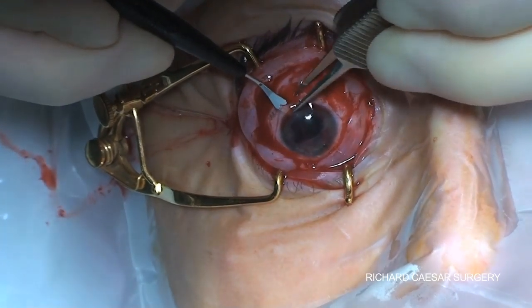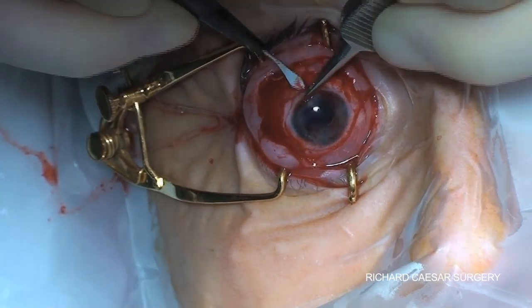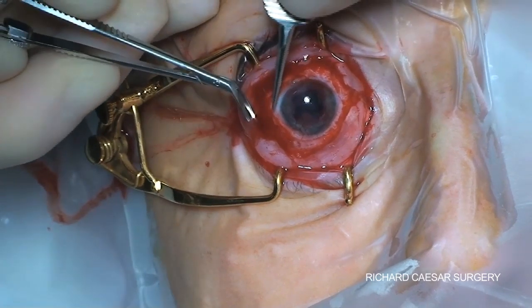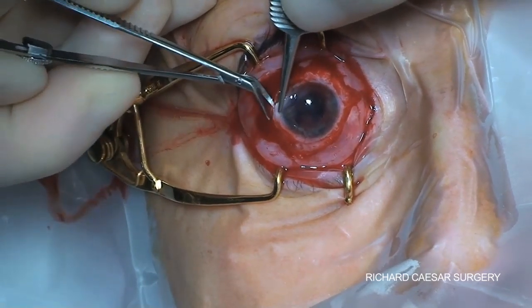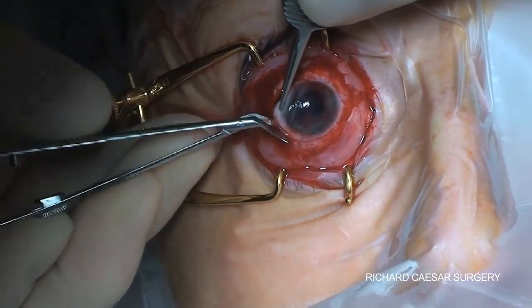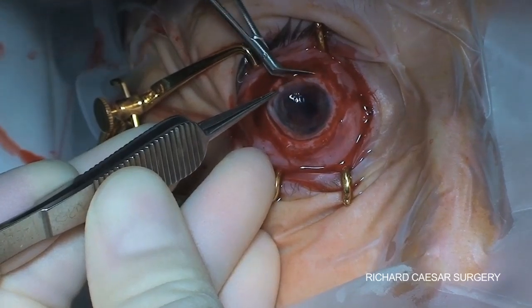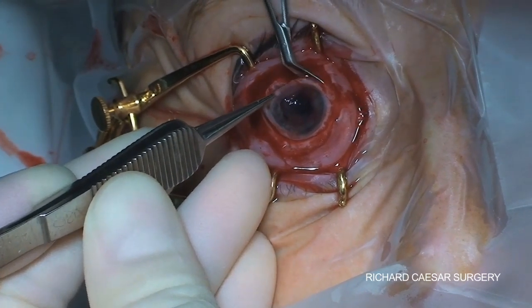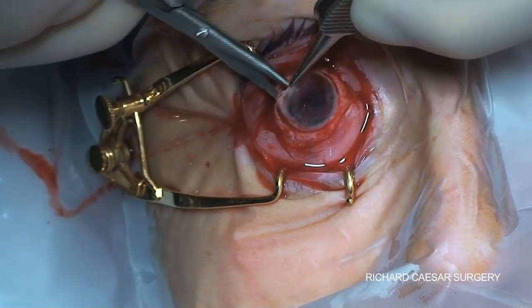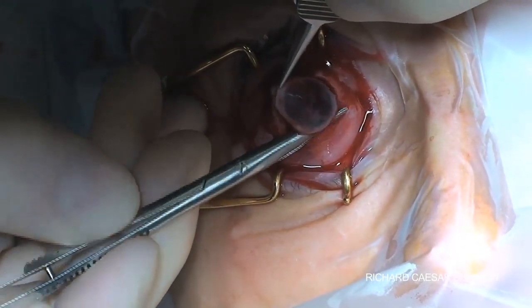I normally use a keratome to initiate the excision, penetrate the anterior chamber, but staying — obviously as you would in cataract surgery — staying away from the uveal tissue at this stage. The left and right corneal scissors are absolutely ideal and you simply slowly and carefully nibble your way around. There's some adherent tissue here that I'm excising and then the cornea is removed.